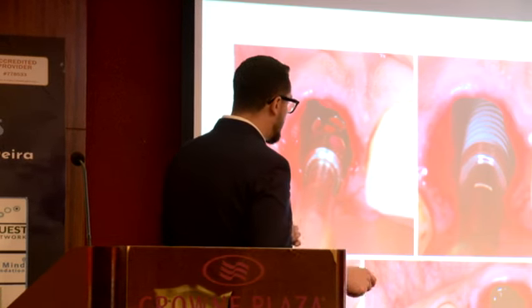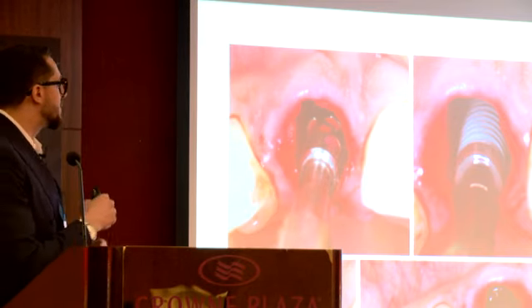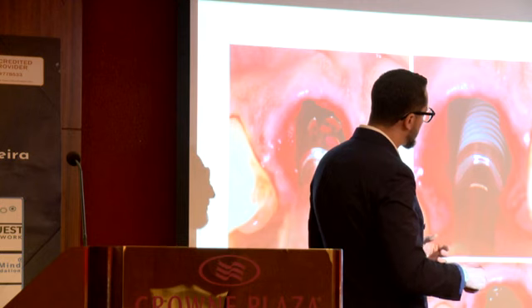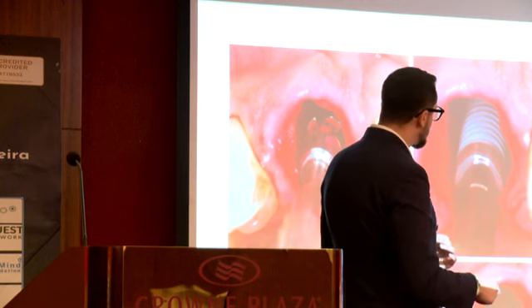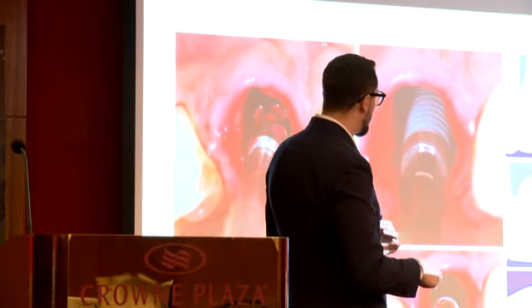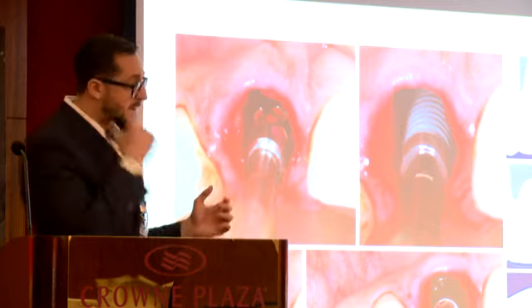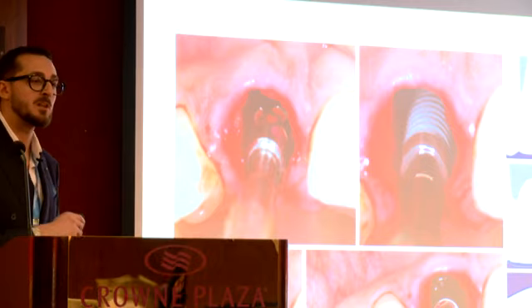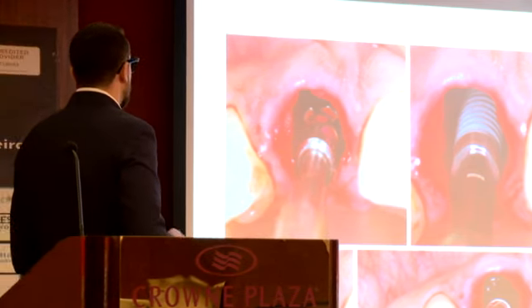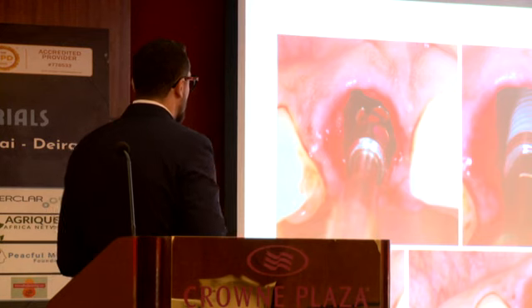And from an occlusal point of view, as you can see, you have to respect this line between the incisal border of the adjacent teeth, and you have to respect a slightly palatal position of the circumference of your implant, in order to avoid contact of the implant surface against the vestibular, the buccal plate, and in order to have the axis of your implant on the palatal side, because I also always practice screw-retained restorations. I don't do cemented crowns.